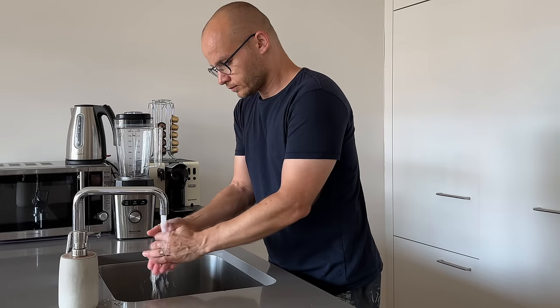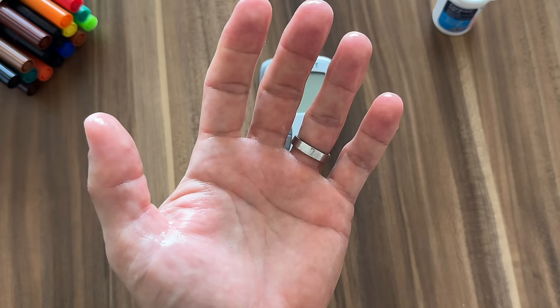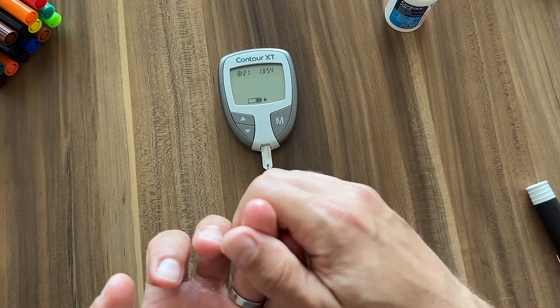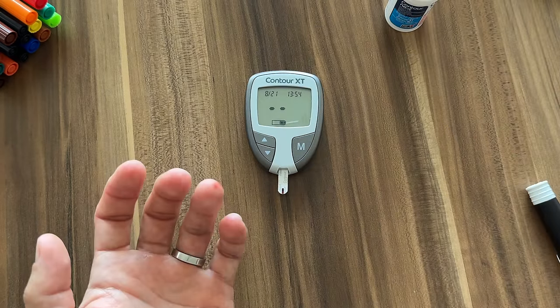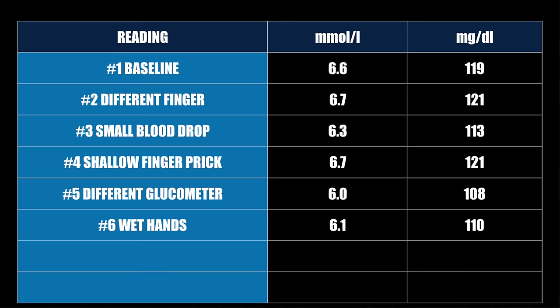For reading number six I washed my hands again but intentionally left my fingers a little bit wet — not drying them off properly — to see what happens when I check blood sugar with wet hands. Obviously the water on my fingers will dilute the blood sample and probably impact accuracy. Reading number six is only 6.1 or 110 — quite a bit lower than the baseline, even though these readings were taken within minutes of one another. If you want an accurate blood sugar number, always wash and dry your fingers with a clean towel.